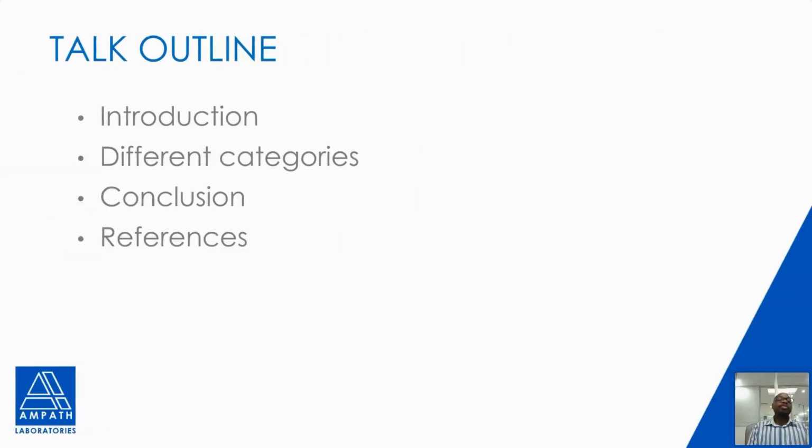The outline of my talk will be an introduction, then I'll talk about the different diagnostic categories of the Bethesda system, and then I'll have a few words of conclusion and then references.